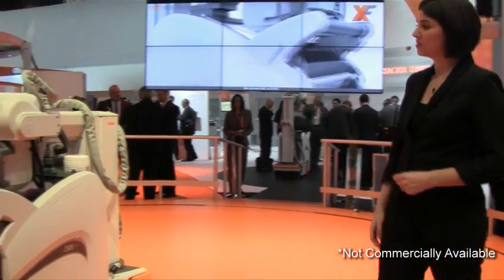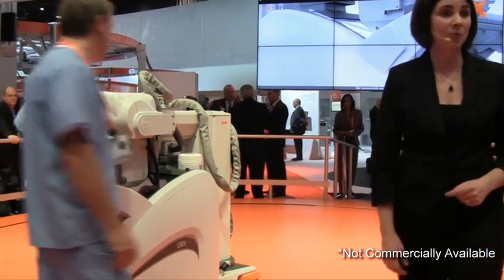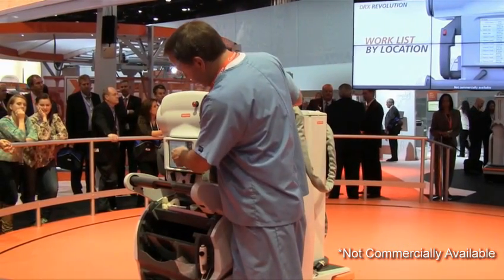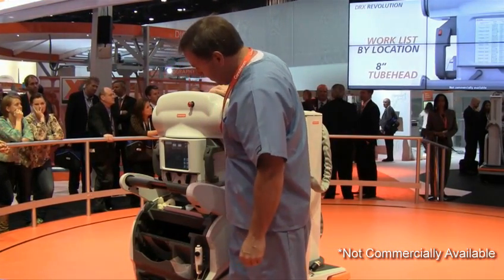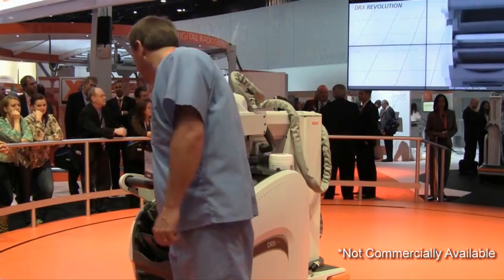And convenience — when this little marvel is finalized, you'll power it up and sign on with a simple swipe of your badge. We are designing the revolution so that your work list, accompanied by room locations, appears on the tube head display. No need to undock the system. Everything you need will be at your fingertips.